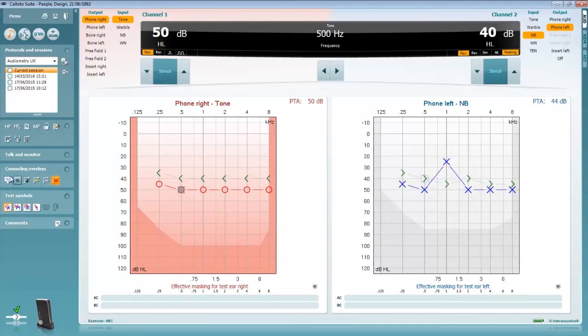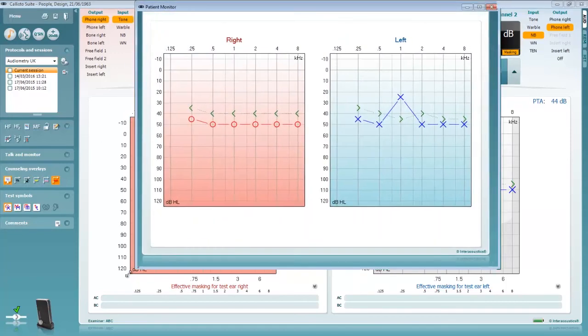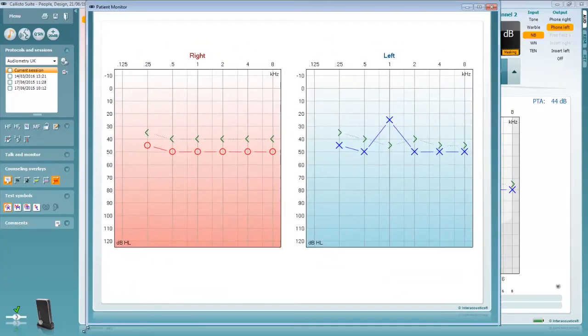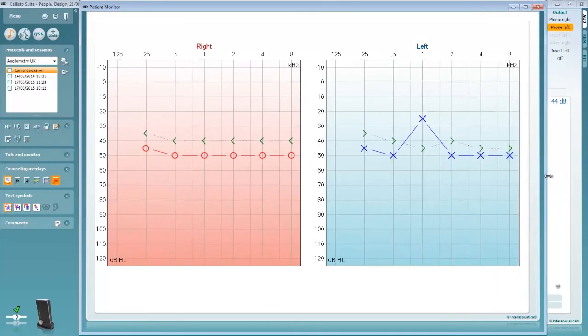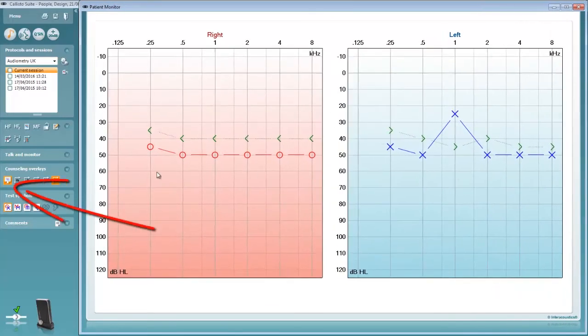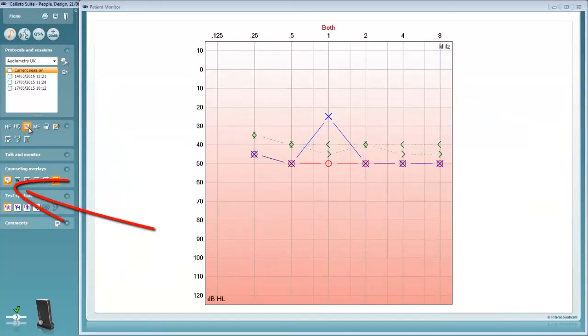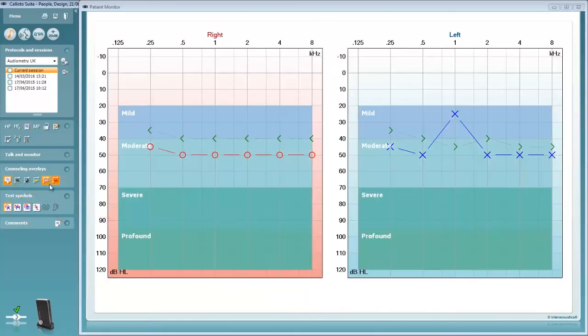Although we can apply these overlays it can still seem overwhelming and unnecessary for the patient to see all the controls from the audiometry testing. This is why we have also developed the patient monitor screen to help display only the information which is important. Again the overlays can be applied to this display.